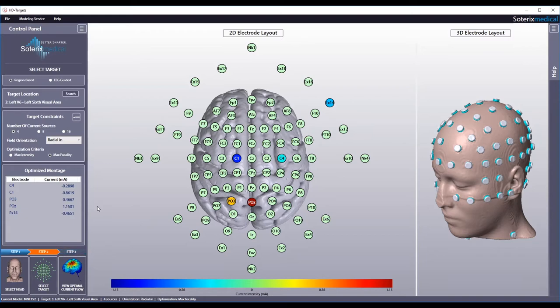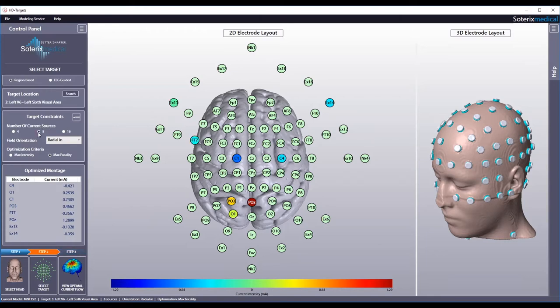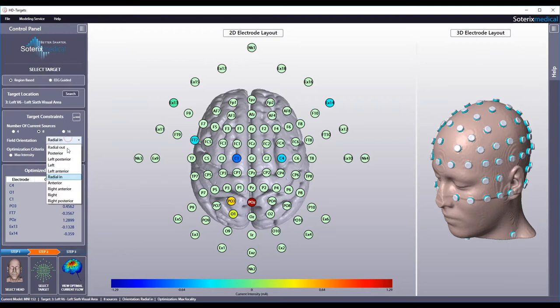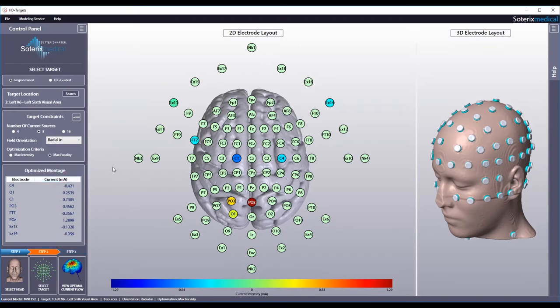Next, choose the number of current sources. This is determined by the AC stimulator that you have. If you have the MXN stimulator with 8 channels, select 8 channels. Finally, select field orientation. For example, select radial if your target is superficial since pyramidal neurons are predominantly oriented normal to the surface.